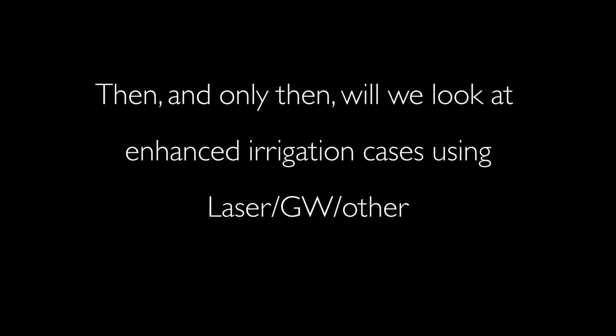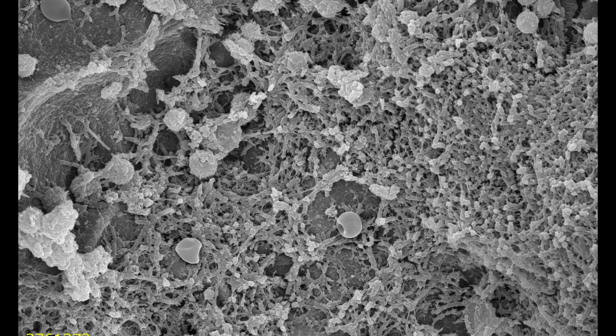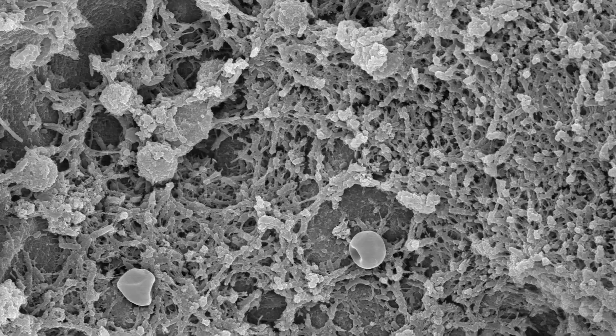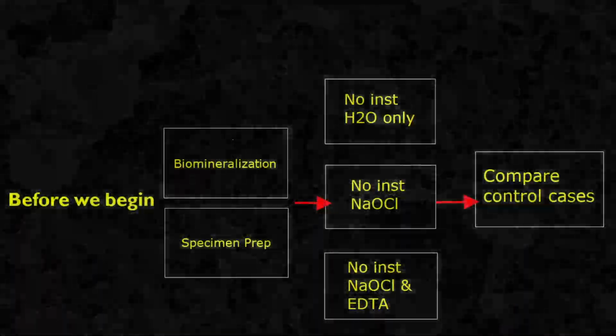Step 3, then and only then will we look at enhanced irrigation cases. And having done all of this, when you look at those cases, you will really have better context for how to evaluate these complex images.